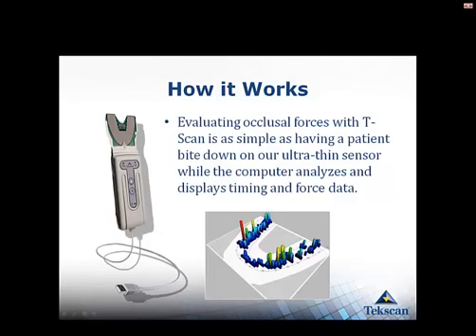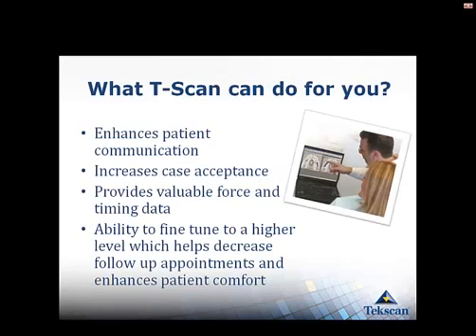So how it works is the patient bites down on the sensor here, and what we're going to get is a readout on the computer screen. And we're going to be able to see the force and timing data.